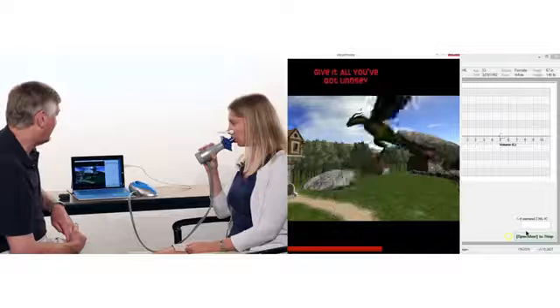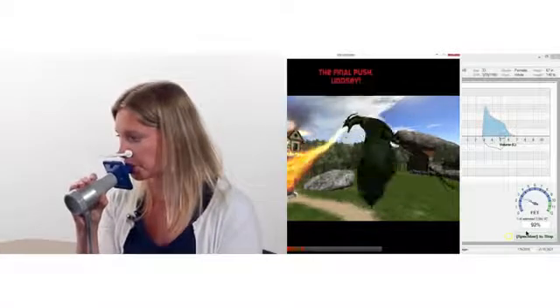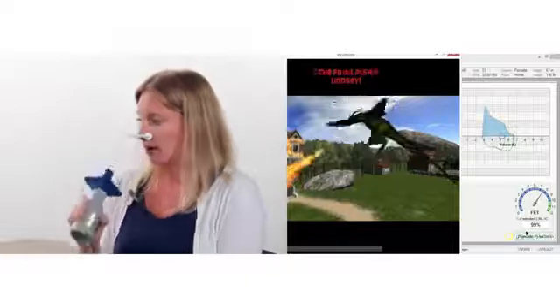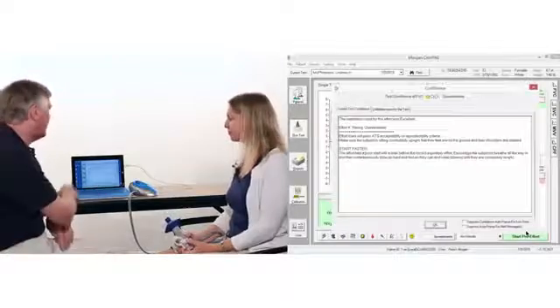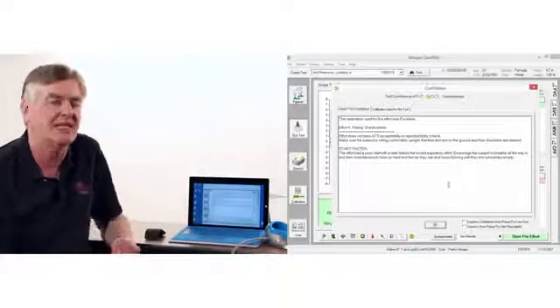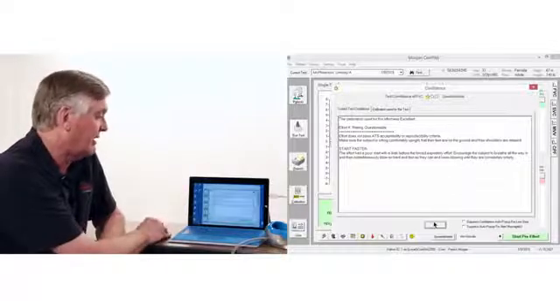And so here we have our dragon threatening the castle. And deep breath in, blast it out. Keep it coming, all the way out, nearly there, and deep breath in. And again, the animations are there to encourage. If there is anything that the software sees that is unusual or not meeting ATS criteria, it is presented to the technician so that you can see what was wrong and how to correct it.